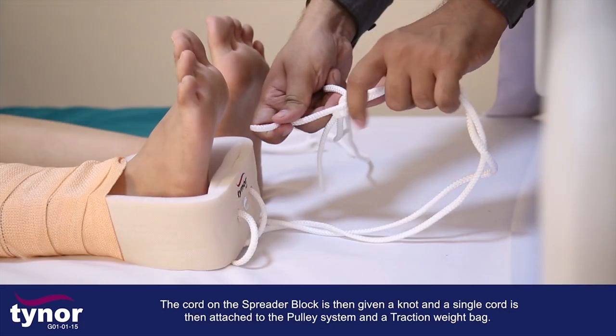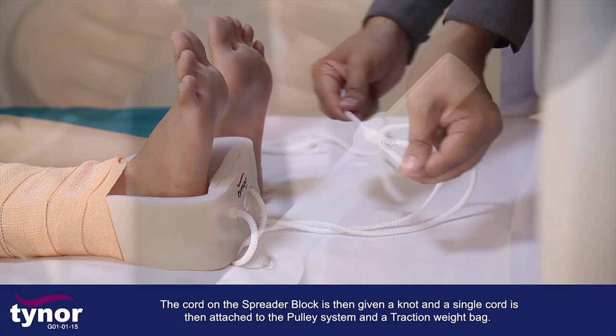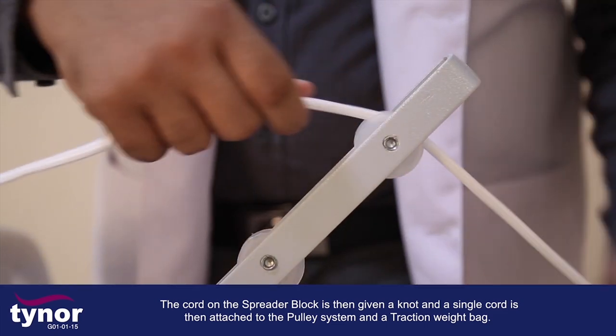The cord on the spreader block is then given a knot, and a single cord is then attached to the pulley system and a traction weight bag.